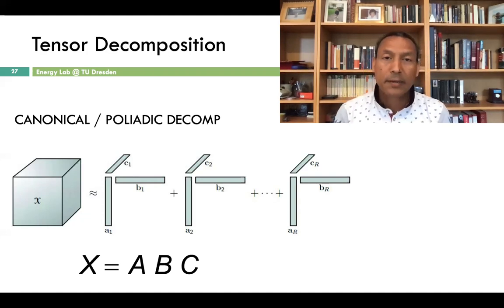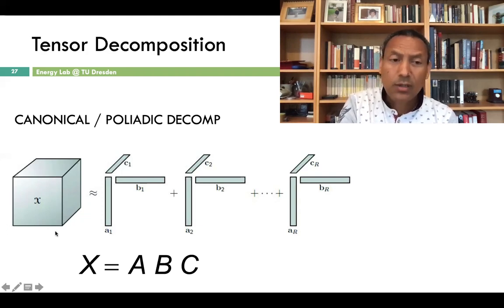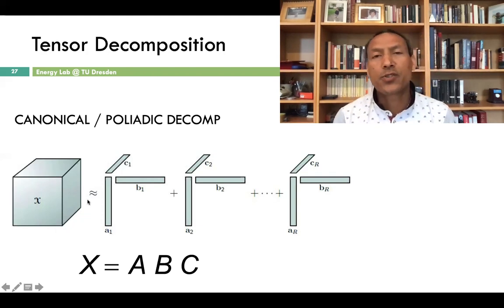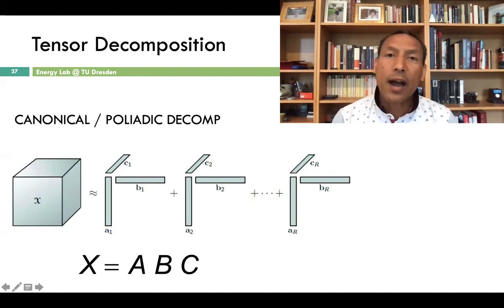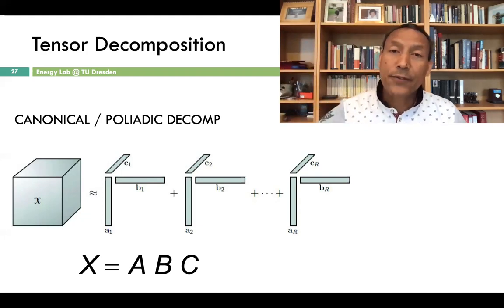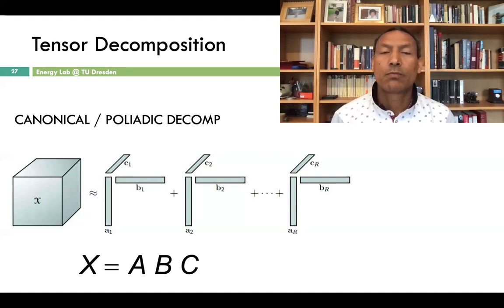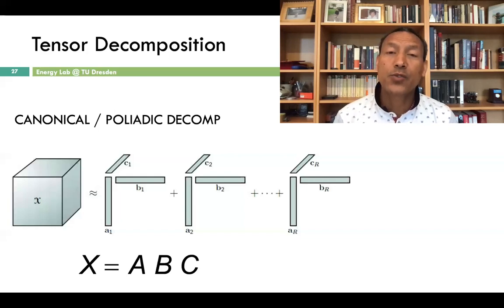Now remember, this dimension is a frequency dimension, this one is a temporal dimension, and this is a channel dimension. Now we are able to diagnose the ECG data from three different or orthogonal views.